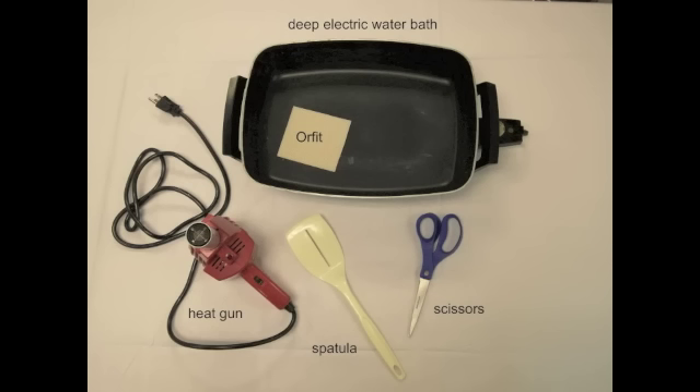You will need a deep electric water bath, a piece of ORFIT material, a heat gun for making minor adjustments, a spatula to turn over the ORFIT while it is in the water bath, and a pair of scissors.